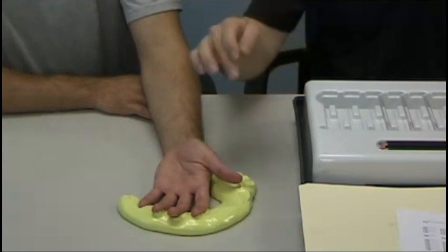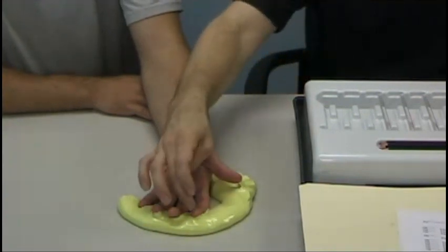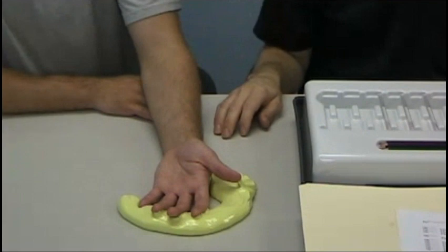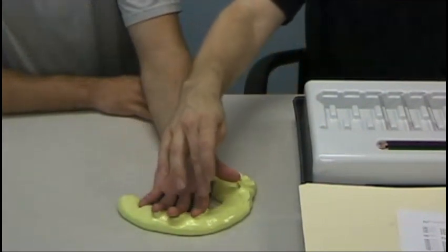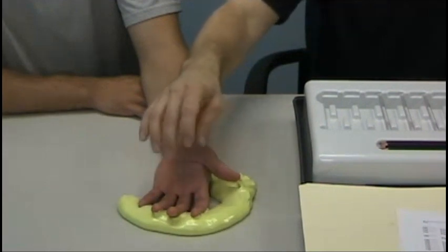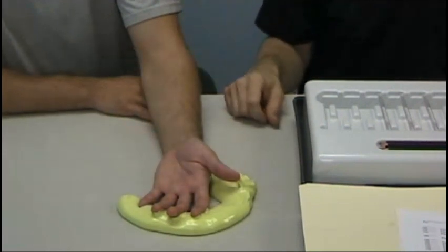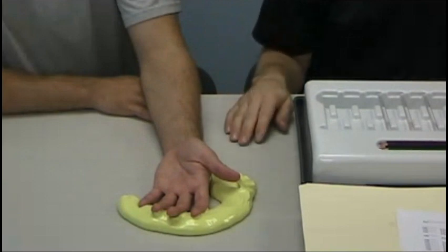You're going to test each digital nerve, so both sides of each fingertip separately. For each hand, if you're doing just the distal phalanx or the fingertips and thumb tips, you'd come up with 10 measurements, one for each digital nerve in each digit.